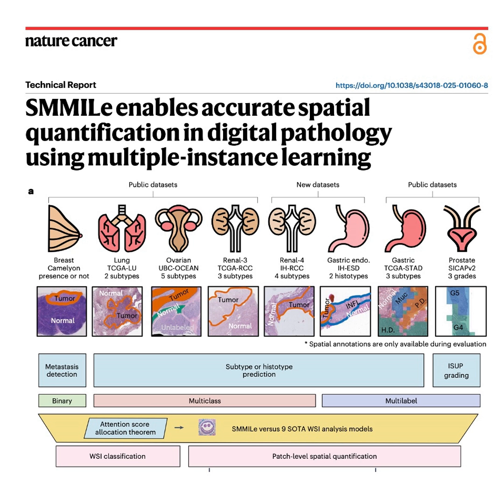Right. So when you combine all 5 of these modules, the neighborhood context, the blindfold forcing it to look harder, the diverse sampling, the healthy baseline, and the spatial peer pressure, you get a framework that doesn't just predict a label, it deeply understands the geography of the tissue. It's a profound paradigm shift when you really think about it.